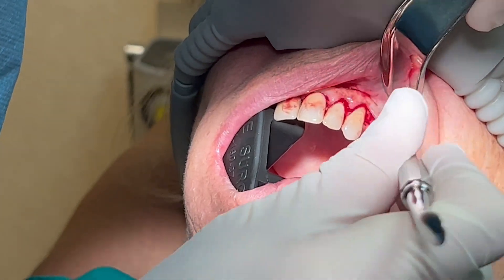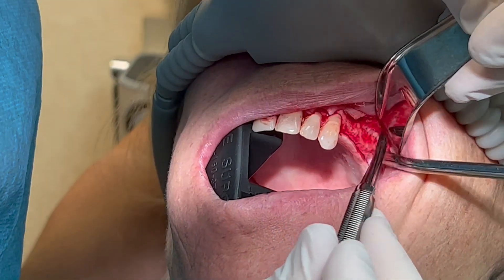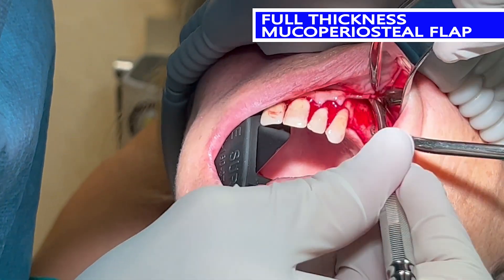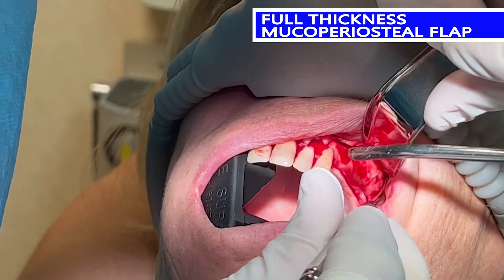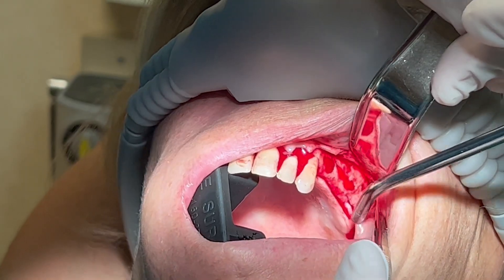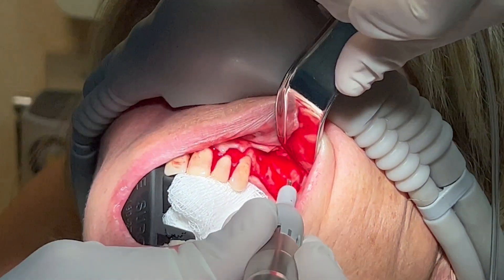Access is key here. I want to make sure that I'm able to retract the flap superiorly without fighting it, so that I'm able to visualize the lateral maxilla. I'm going to make a lateral window in the vicinity of where I know the sinus is, and also where the implant is based off of the CT scan.